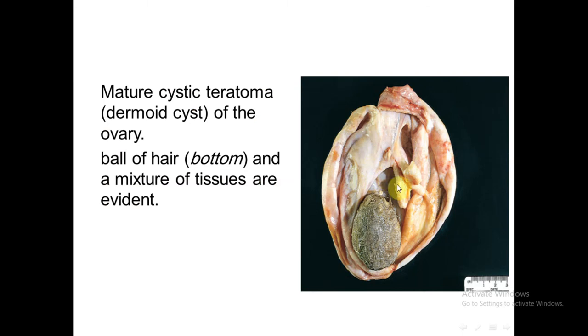Here is a gross feature of mature cystic teratoma, also known as dermoid cyst. The word dermoid comes from the most common component of this cyst, which are the components of ectodermal origin, including skin and neural tissue.